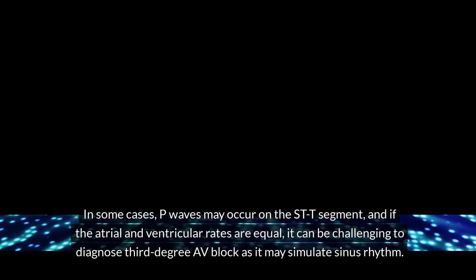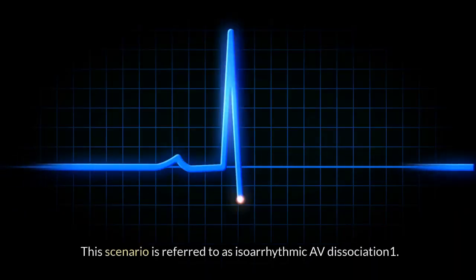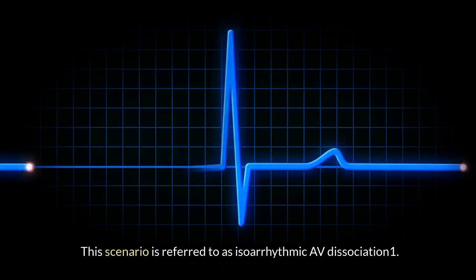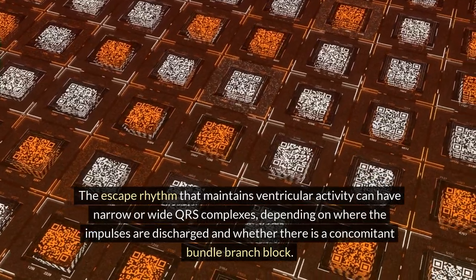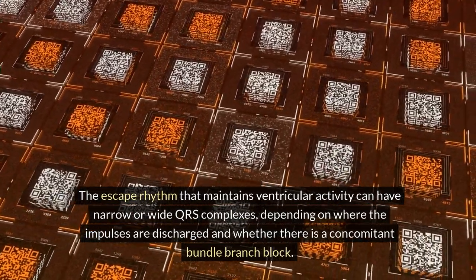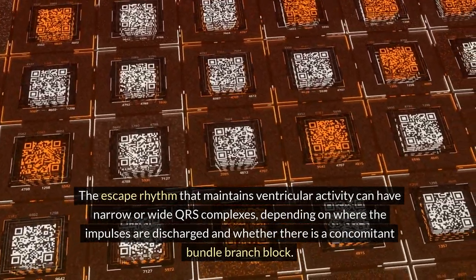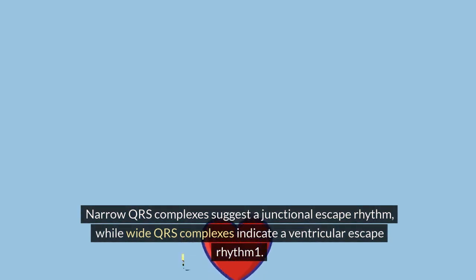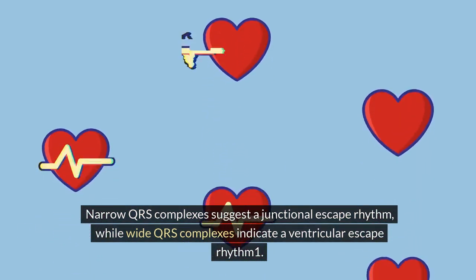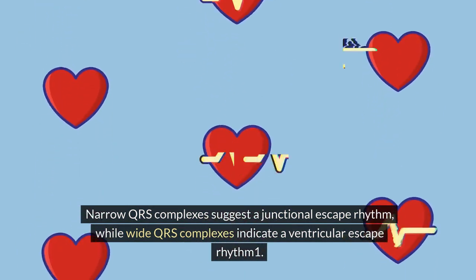ventricular rates are equal, it can be challenging to diagnose third-degree AV block as it may simulate sinus rhythm. This scenario is referred to as isorhythmic AV dissociation. The escape rhythm that maintains ventricular activity can have narrow or wide QRS complexes, depending on where the impulses are discharged and whether there is a concomitant bundle branch block. Narrow QRS complexes suggest a junctional escape rhythm, while wide QRS complexes indicate a ventricular escape rhythm.